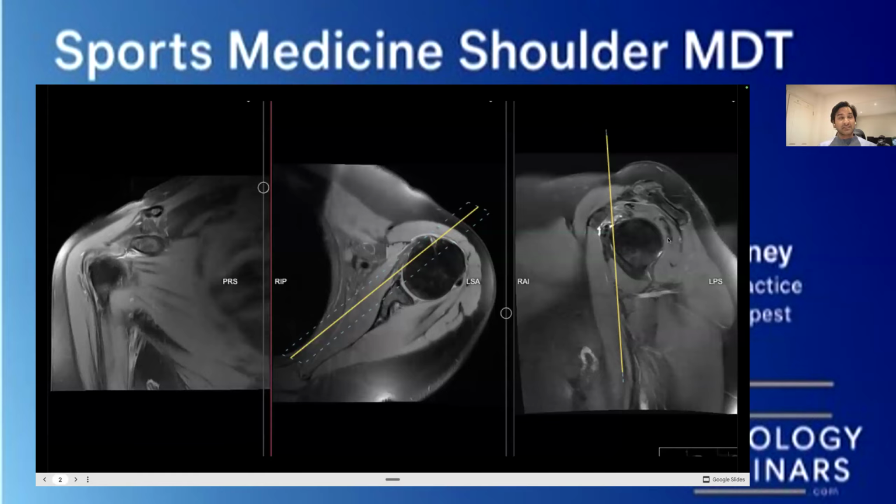Now, interesting case because you don't normally get it there. You normally get it in the supraspinatus tendon. But we've got a few things going on, right? We've seen that there is a bit of tendinosis located in the supraspinatus tendon. We saw acromioclavicular junction osteoarthritis with some osteophytosis, which is resulting in some narrowing, i.e., impingement. We saw a little bit of fluid and a slight abnormal signal of the biceps tendon, which makes you wonder whether they've got slight tendinosis.